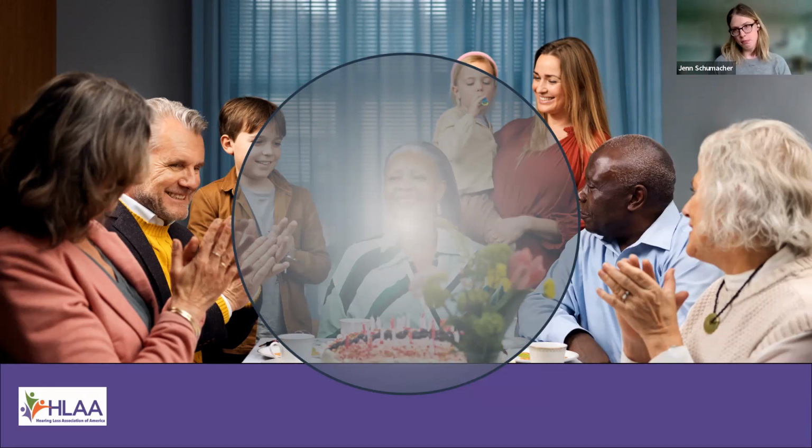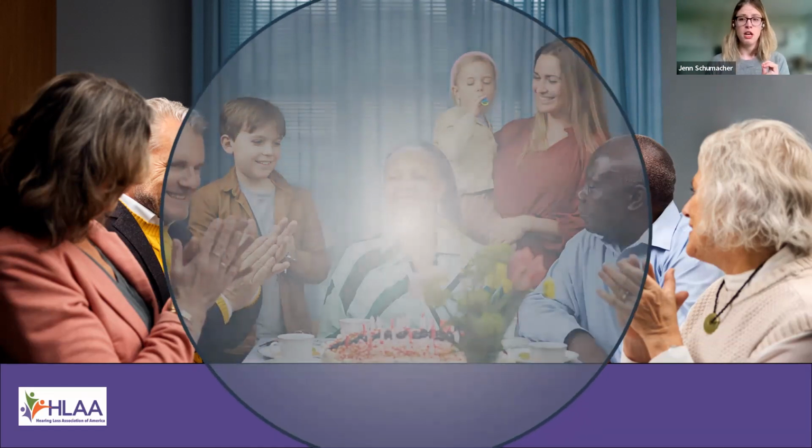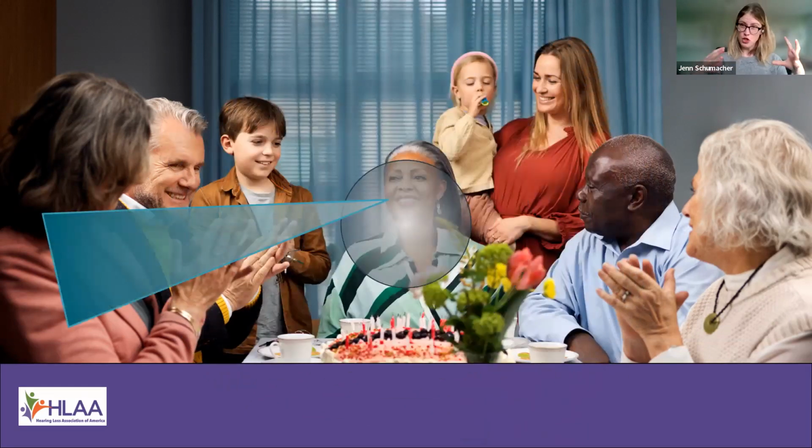So not only are we going to be amplifying anyone talking that she might want to listen to, but it's going to be amplifying everything. And that's just going to be really overwhelming and too loud. And all that noise is really going to cover up a lot of what she may want to hear. So it's definitely not the best strategy for this situation. What most hearing aids will do is instead reduce that overall surrounding amplification.